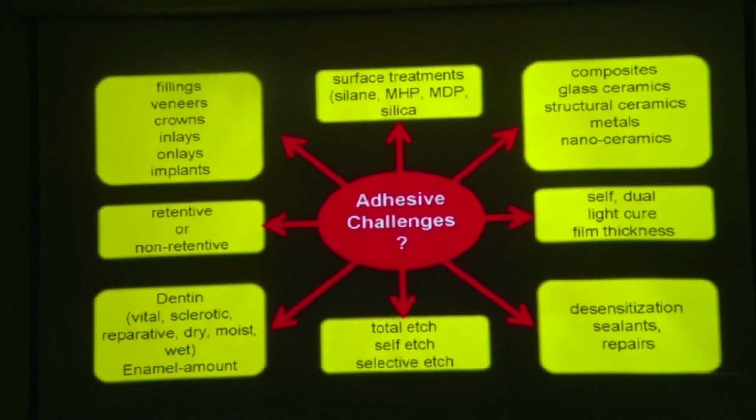So when I'm using a resin cement to lute a ceramic laminate, please remember you have to use only the base paste of your resin cement. Please don't mix the base and catalyst. Most of the cements available, for example Calibra from Dentsply, are available as a two paste system where you have base, catalyst and two bonds: one light cure bond and one self cure active. In India, they don't promote veneer cement made only for veneers because there are not many takers. But you can use these cements.